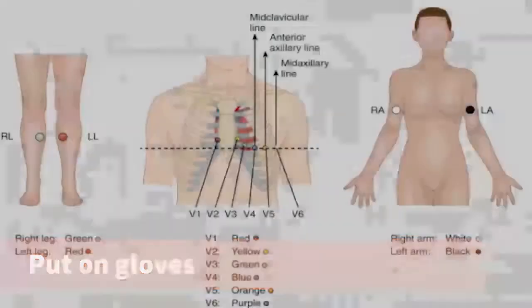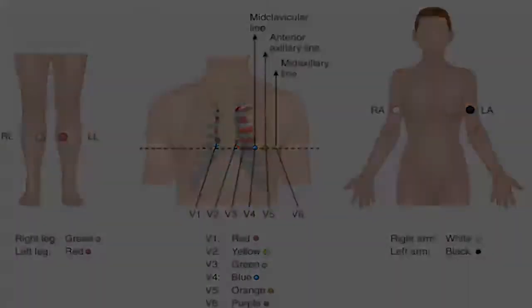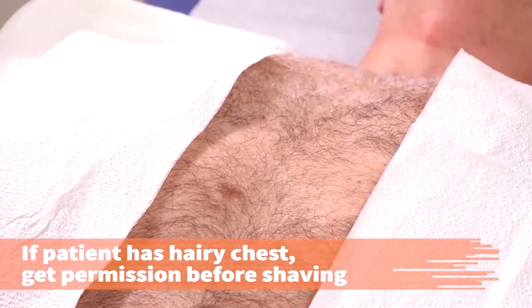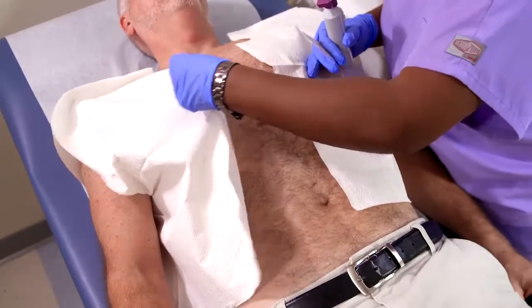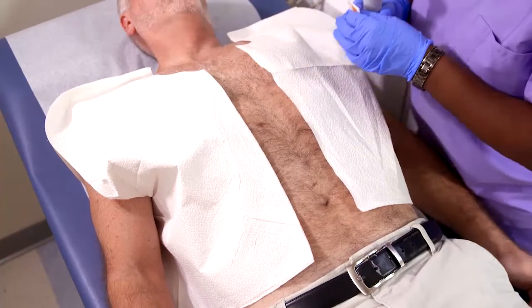Put on disposable gloves. Identify the locations for the ECG electrodes on the chest. Prepare the patient's skin. If the patient has a hairy chest, get the patient's permission prior to any shaving. Alright, Rick, I'm going to have to shave you a little bit in the different spots where I place the electrodes — is that okay? Sure.